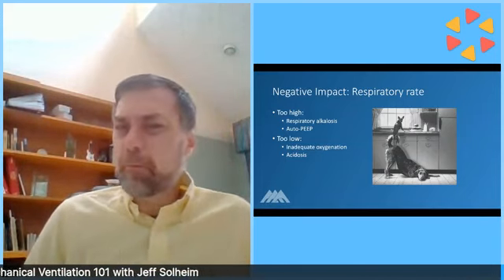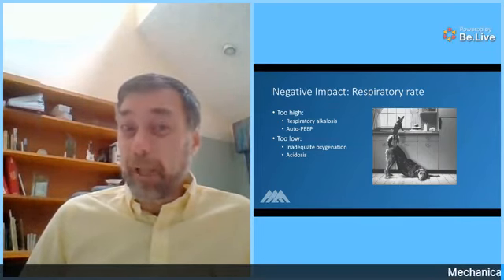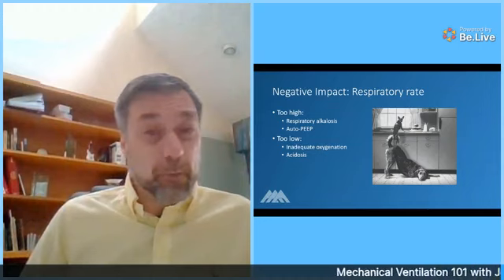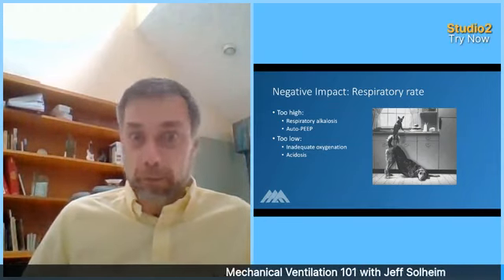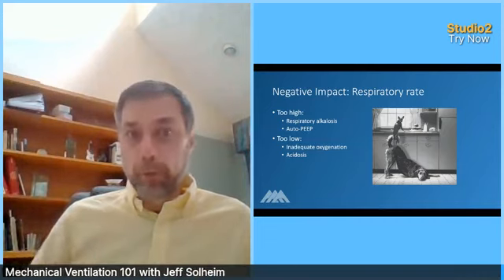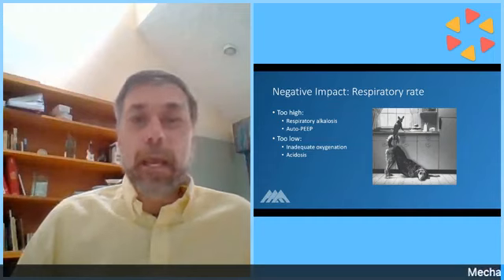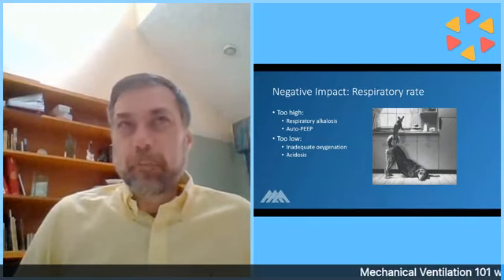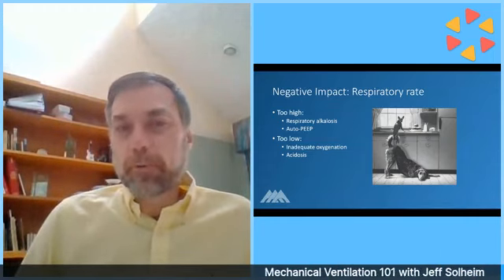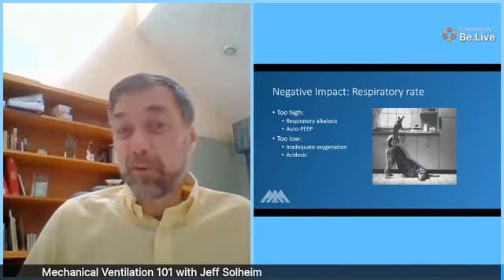Therefore, using elevated respiratory rates, you've got to be careful on a ventilated patient that's paralyzed, because if you start turning it up too high, they're not going to exhale, and you're going to end up with really high pressures on the ventilator and either blow out alveoli, or your ventilator is just going to have high pressures and not give a lot of air each time. Most of the time, we would say the highest you'd want a respiratory rate to go on a ventilated patient who's paralyzed is about 20 breaths per minute. So, I mean, that's going to help.